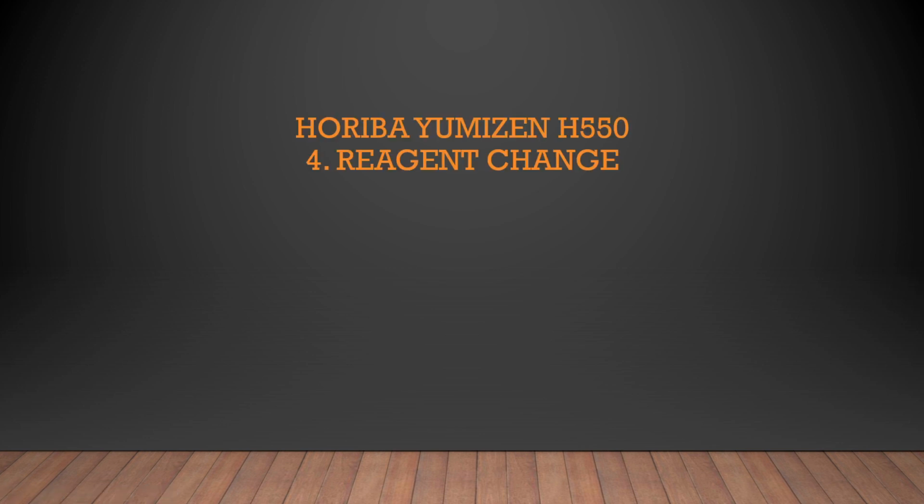In this video, we try to learn about how to change reagents in Yumizen H550. Always remember, unless there is an emergency, usually we change the reagents only in the night time, and that too after the instrument is given start. So you start the whole instrument, and then before it asks for a startup, during that time we change the reagent, then give the startup and finish it.